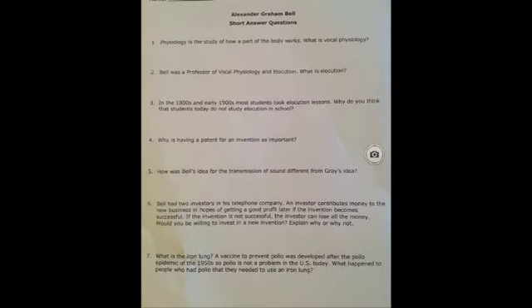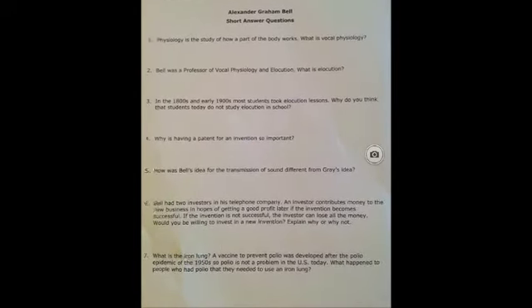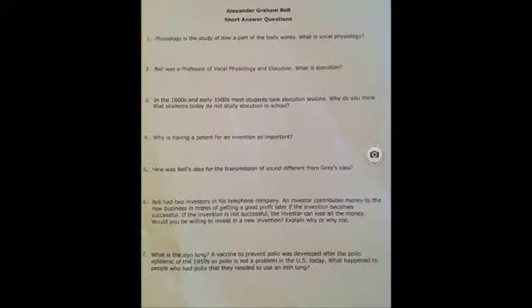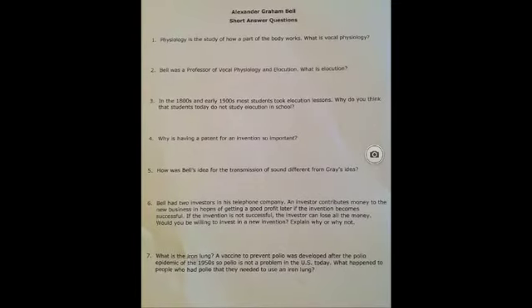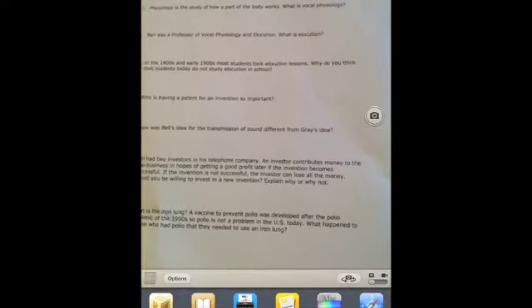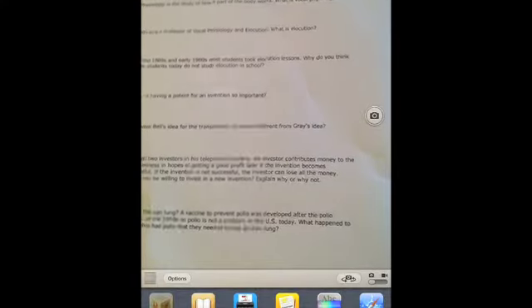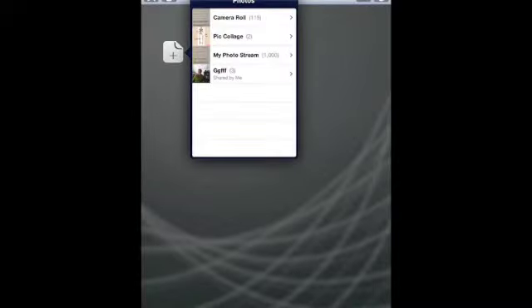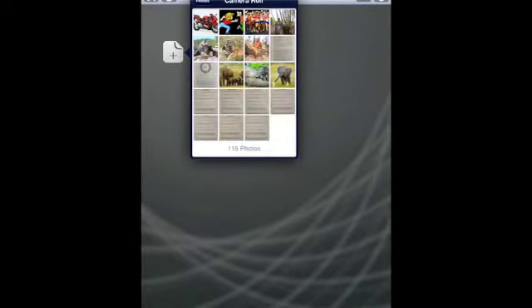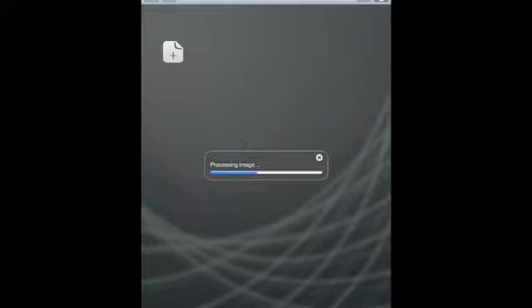I'm going to hold my iPad over the document very still, snap the picture. I'm going to double tap on the home button to very quickly get to my ReadIris app. Go to plus, camera roll. It's going to process the image and flip it accordingly.